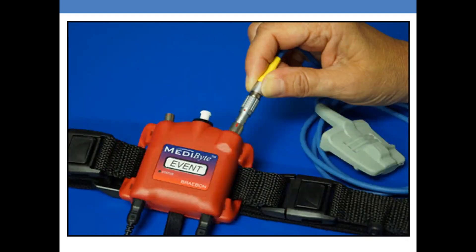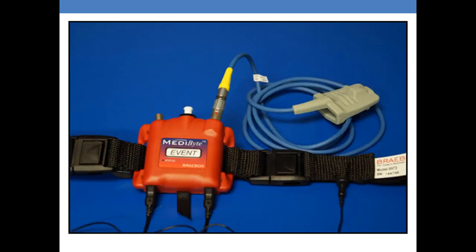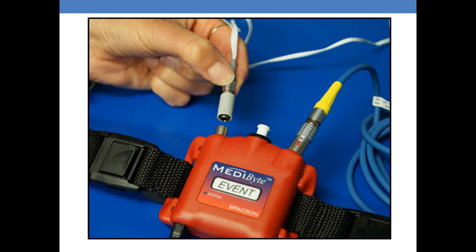When inserting the pulse oximetry, it is important to line up — on the Metabyte Light there's a little red edge, and there's also one on the metal part of the pulse oximeter. Please make sure that those are both lined up prior to inserting.